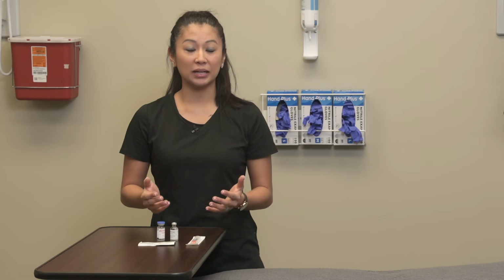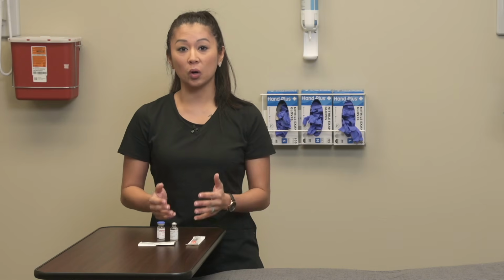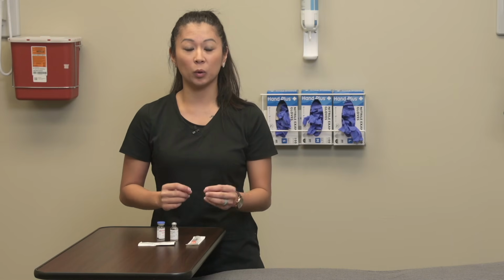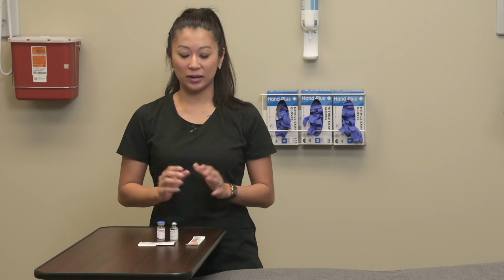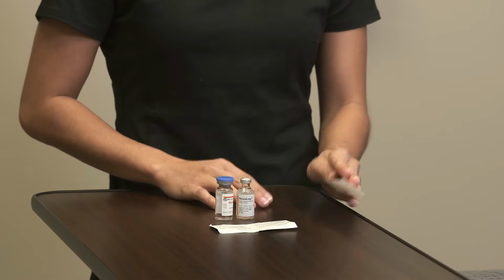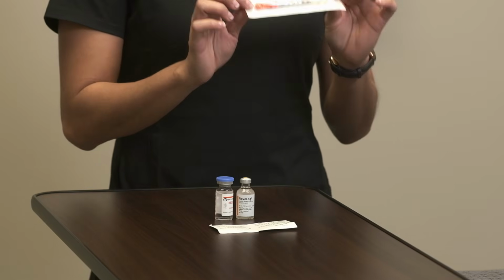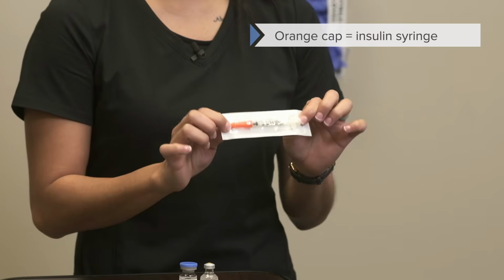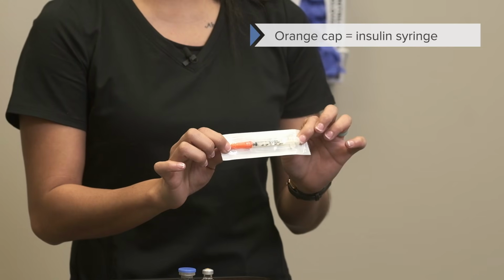Also, when we draw up medications, we are typically drawing them up in the medication room, so we are not close to the patient or in the view of the patient. That also helps. All right, so first of all, let's take a look at our equipment. We've got a very common subcutaneous medication injection needle. If you remember from previous, this has an orange cap, which typically means that we are giving an insulin injection.